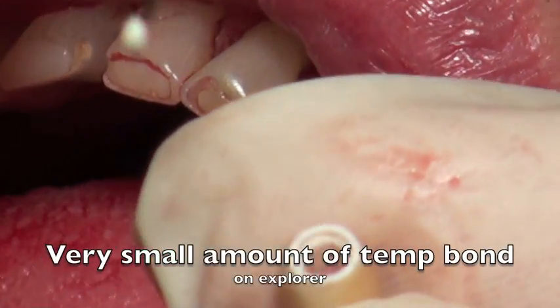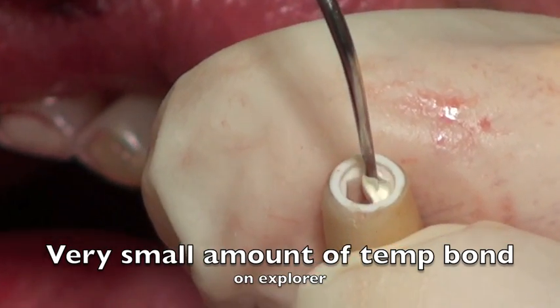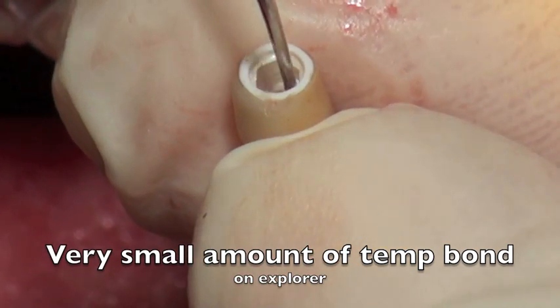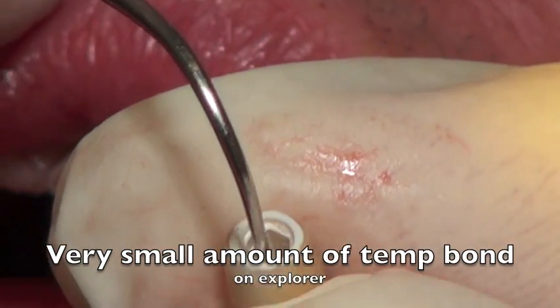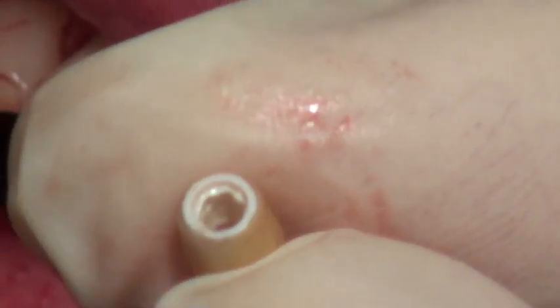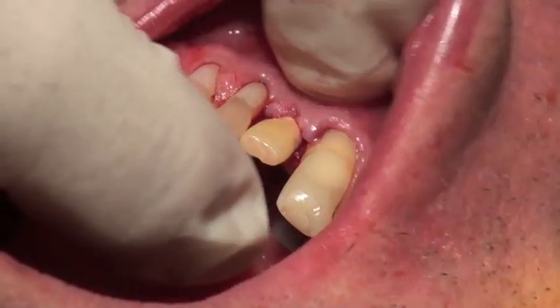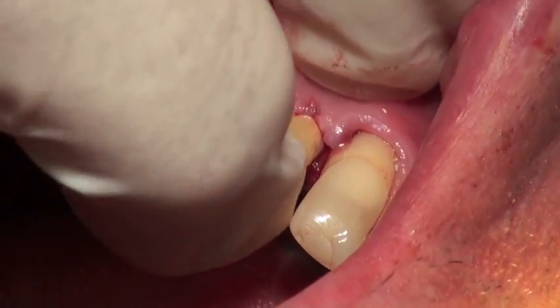Now here's the most important tip of today's lecture: use only a very, very small amount of Tempom when you cement this on. We don't want any expressing underneath the fresh surgical area. Take an explorer and apply the cement inside the temporary crown, then place it on and make sure none is expressing into the sulcus area.